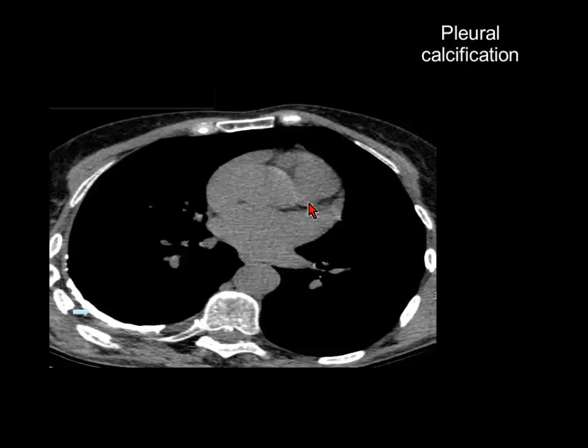If you are going to look only for a specific pathology — for example, only in the bone window — you may miss all these findings.